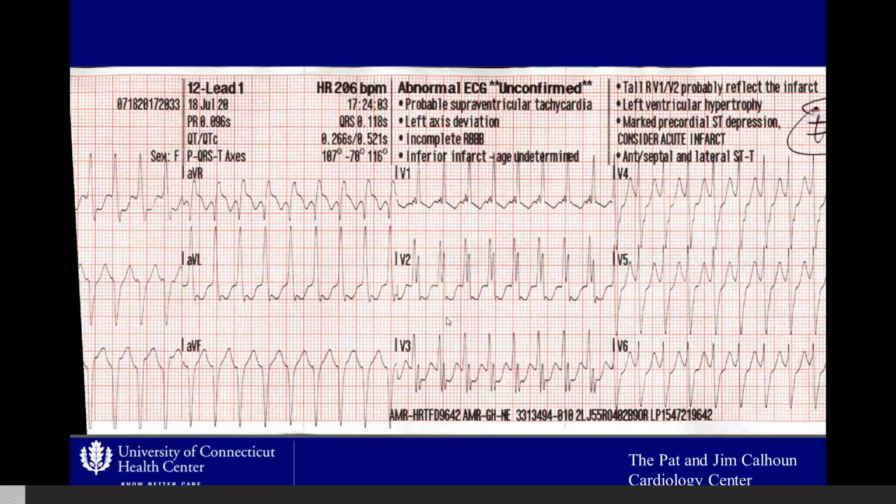So the left posterior fascicle is involved here. You ablate this, you look for this area, and it's basically a micro-reentry circuit that you have. And because it uses part of your conduction system, typically the tachycardia is a little bit more narrow. So Belhassen tachycardia.